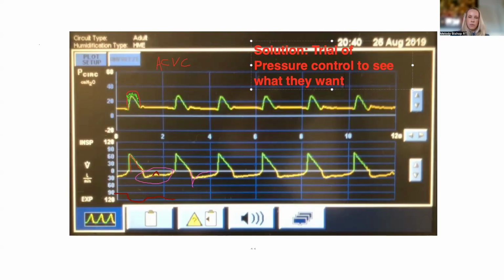frequent. So for me, if you have a patient with emphysema, if they want a 700 ml total volume, but they're going to breathe 12 times a minute, I'd much prefer that over a 450 total volume and then breathing 30 times a minute, right? Because as you get faster, you're going to build auto peep and things are going to sort of get off the rails.